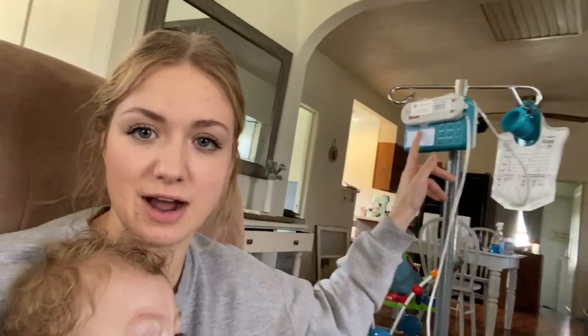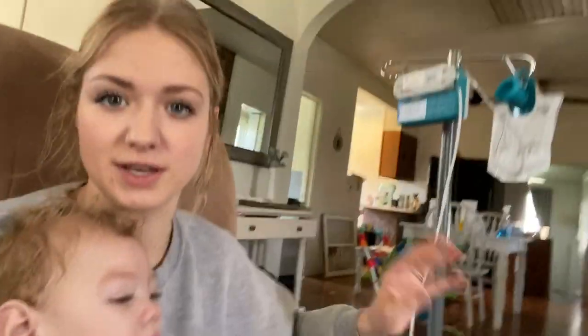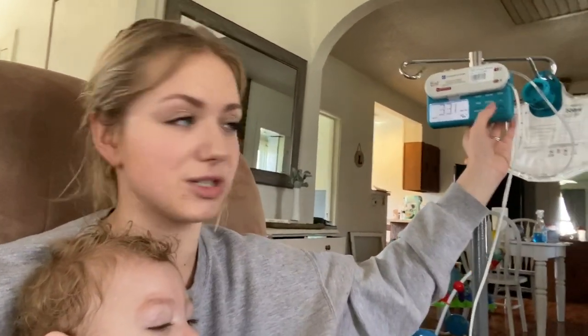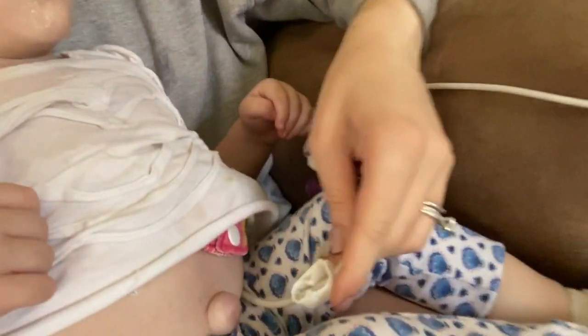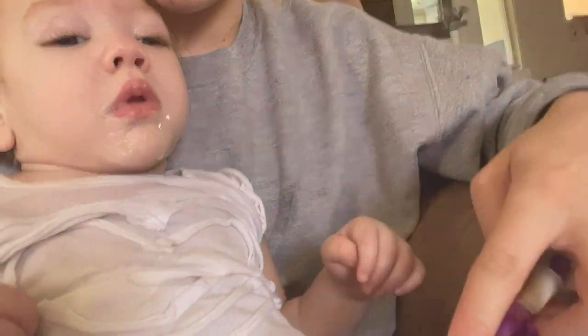Kendall's exhausted so I think I'm going to lay her down for a nap. When the formula is all out, you can see it stopped right here — there's no formula left. There's about 20 mls remaining in the line but it's very little so I don't bother with it. I stop the pump, clip the line, unhook it — which takes two hands — unclip it, and then I'll do a flush: I'll run water through the tube so there's not just formula sitting in her tube.